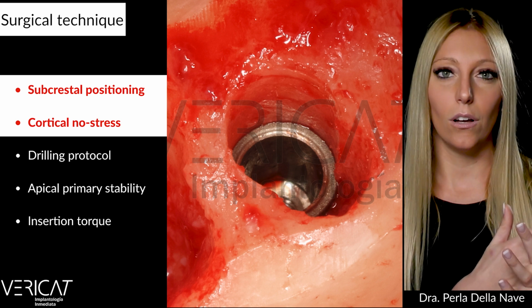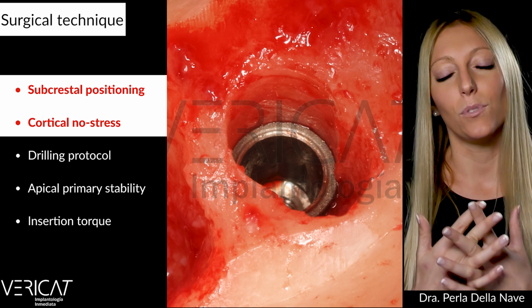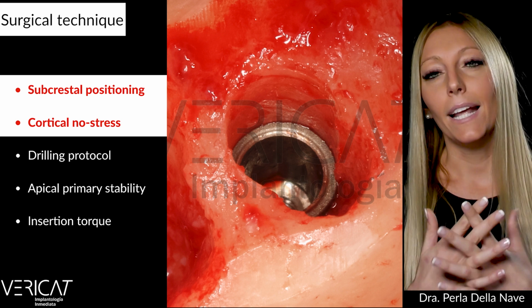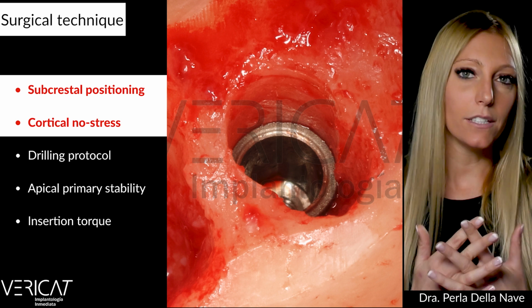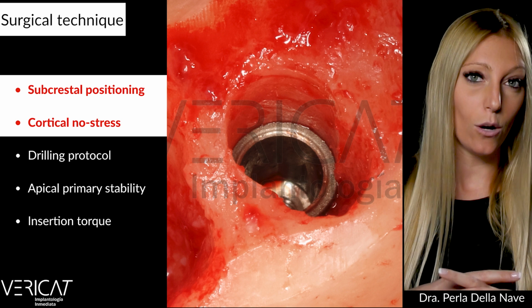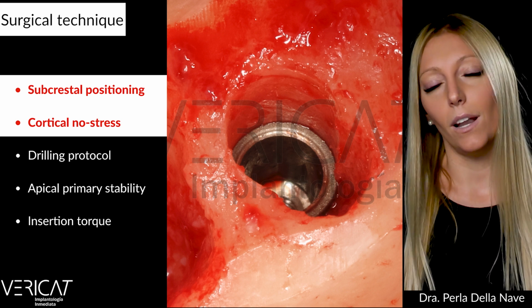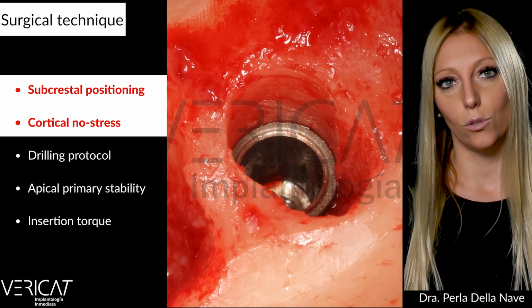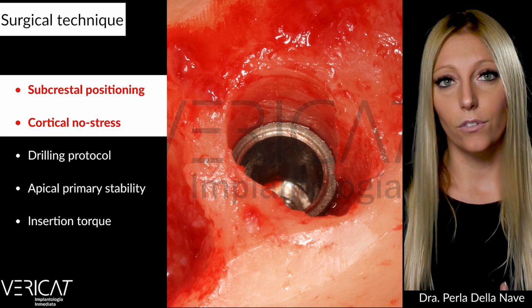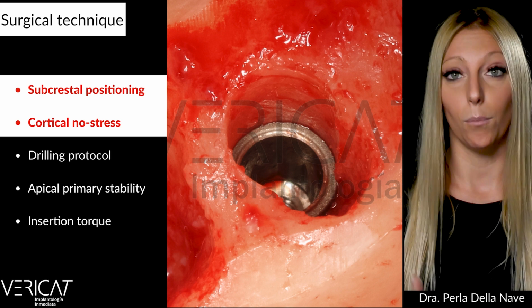The positioning of the implant you see in the picture, for example, that is the depth, that is the position we like. An ideal depth may be approximately 2 millimeters, but in our daily practice, if the bone quantity and quality allow us to do that, we prefer to position the implant at a deeper level, up to 3-4 millimeters below the crest, sometimes even deeper, for example, in cases of unfavorable post-extraction sockets or double cortical ridges.